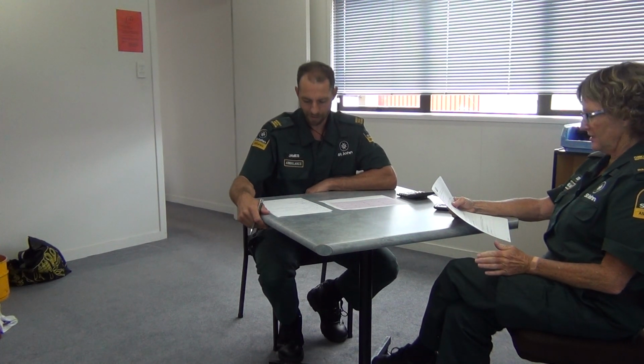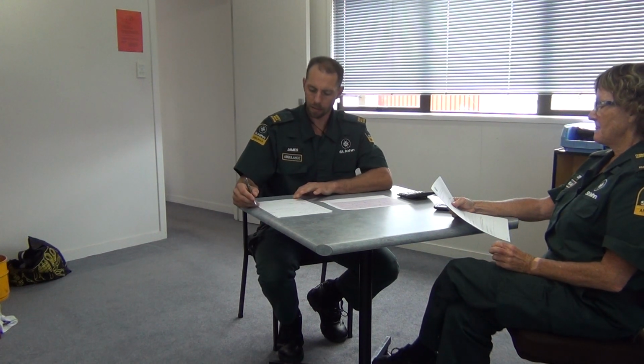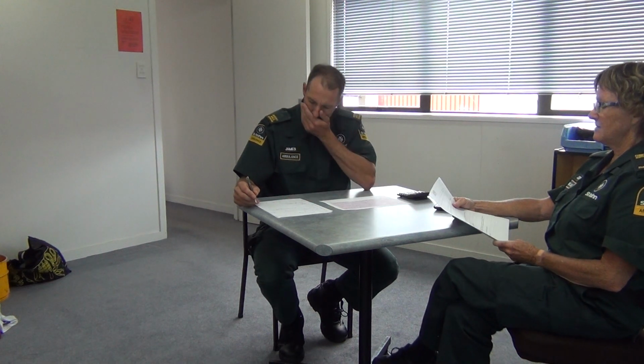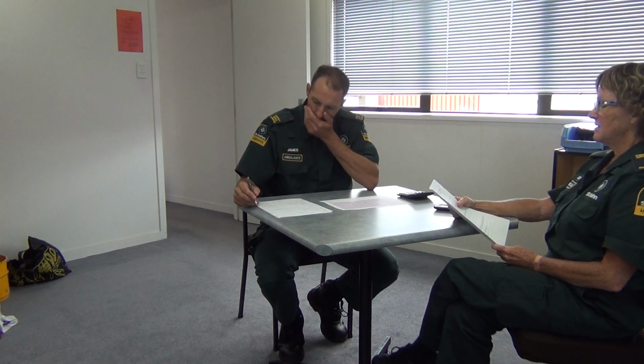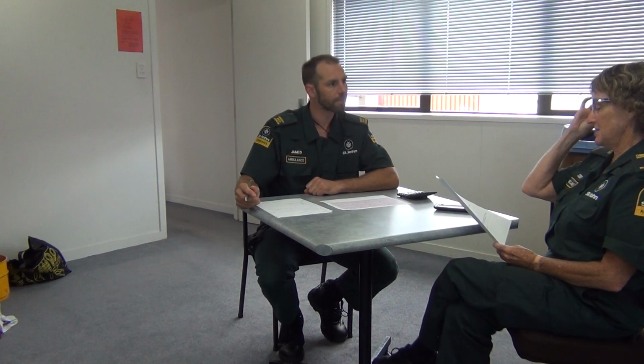Just one more time. Read that again, thanks. 52-year-old male on the golf course for 20 minutes. Developed central chest pain and vomited. Conscious collapse, witnessed, non-injury. Golf partner called the ambulance. He's pale and sweaty, 7 out of 10 pain.